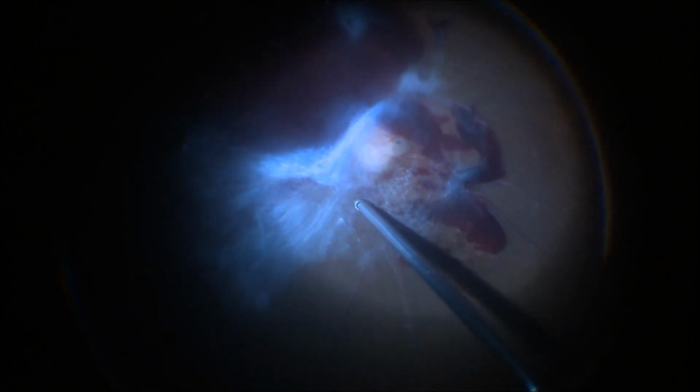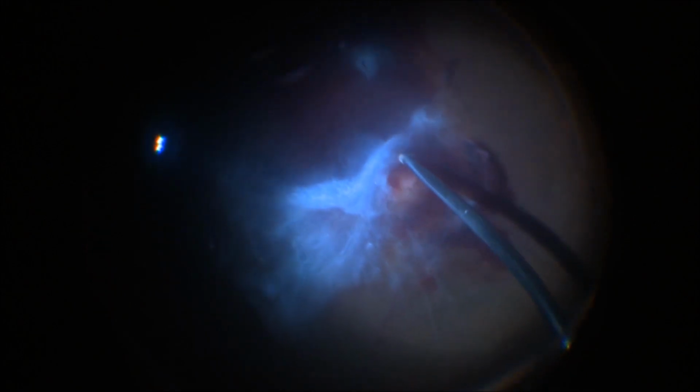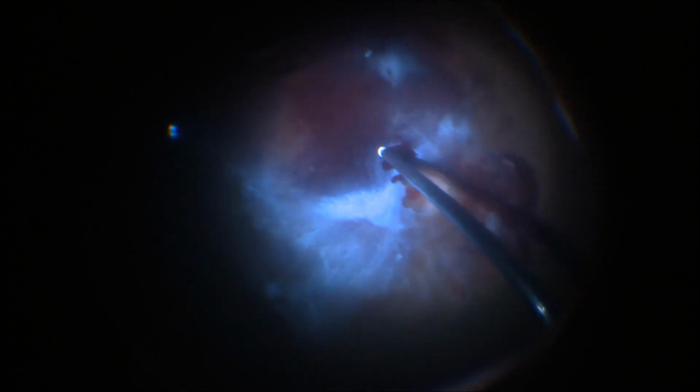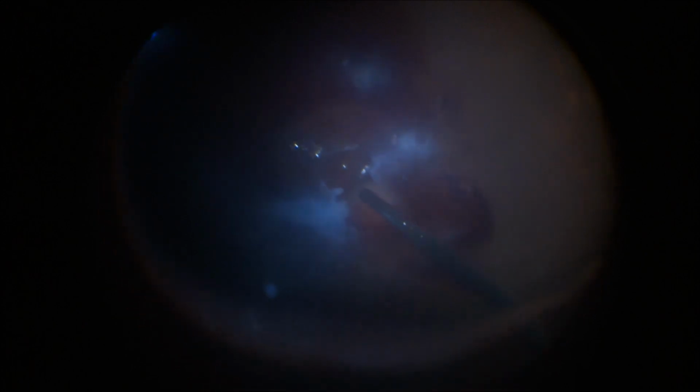The second video is also a similar case in which there is presence of a thick hyaloid face which is firmly adherent to the underlying retina. There is presence of a subhyaloid bleed. So after creating an opening between the retina and the hyaloid face, PFCL was injected to further cause the separation of the hyaloid from the retina.